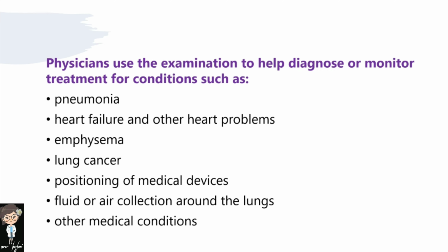Now we will see what are some common uses of X-ray procedures. Usually in any surgical emergency or diagnosing any disease, physicians recommend X-ray as the first monitoring test. Usually it is performed in breathing difficulty, bad or persistent cough, chest pain or injury, or fever. Physicians use the examination to help diagnose or monitor treatment for pneumonia, heart failure and other heart problems, emphysema, lung cancer, positioning of medical devices, fluid or air collection around lungs, which will be discussed in this topic one by one.